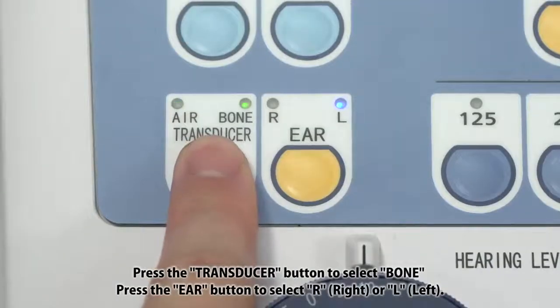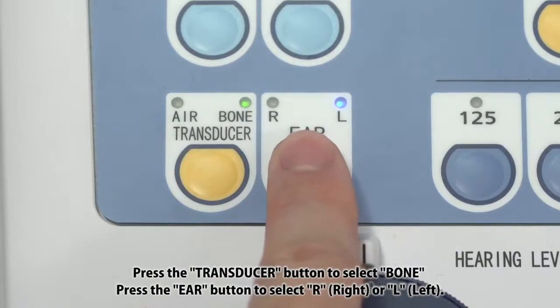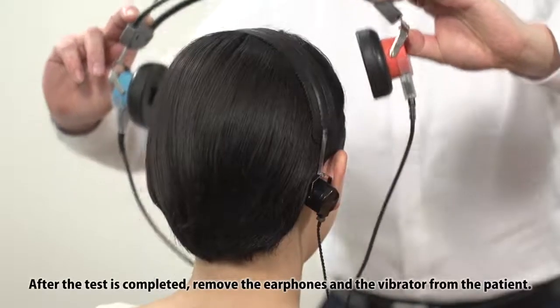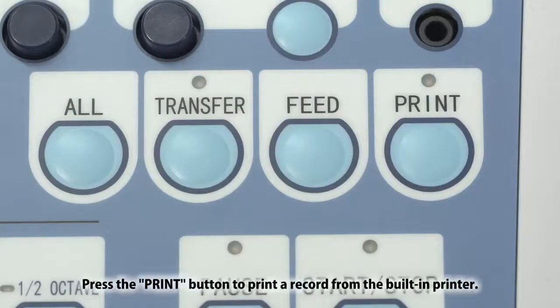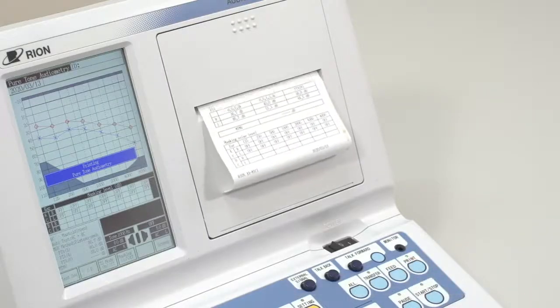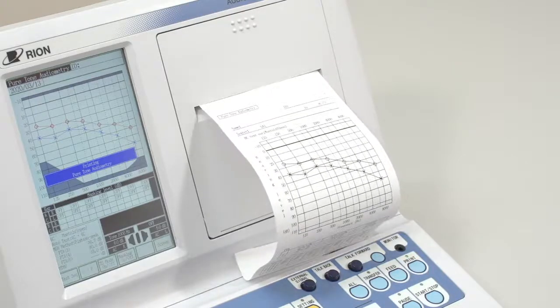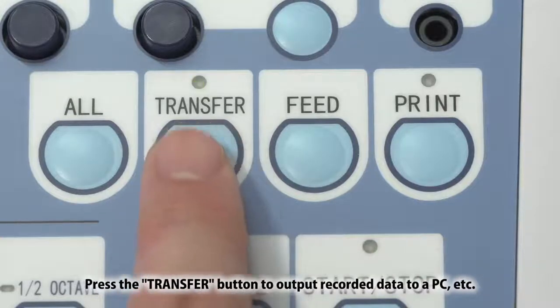Press the transducer button to select bone. Press the ear button to select R or L. After the test is completed, remove the earphones and the vibrator from the patient. Press the print button to print a record from the built-in printer. Press the transfer button to output recorded data to a PC, etc.